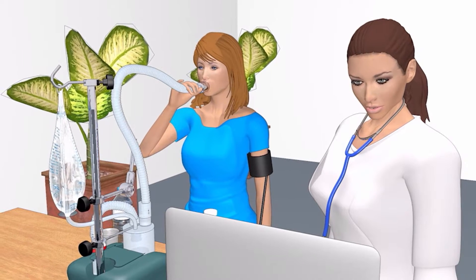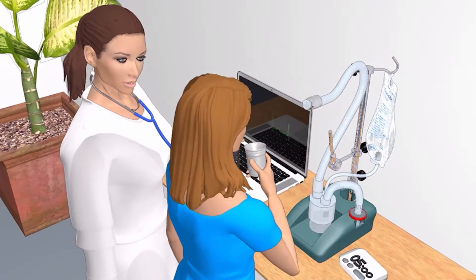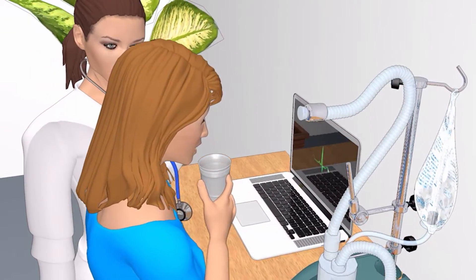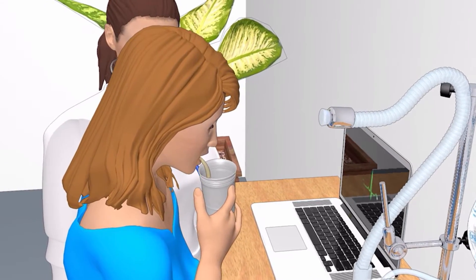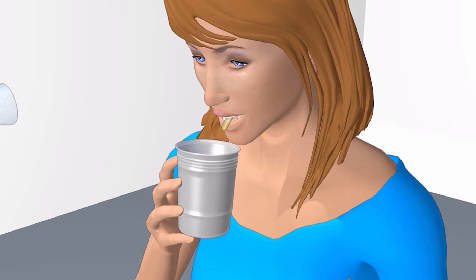After the 5 minutes are up, we will have you swish your mouth out with regular water and spit into a disposable container. After swishing your mouth out with water, we will need you to cough the sputum from deep inside your lungs and spit into the provided sample collection cup.